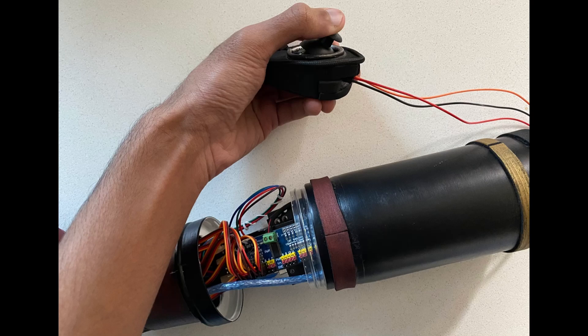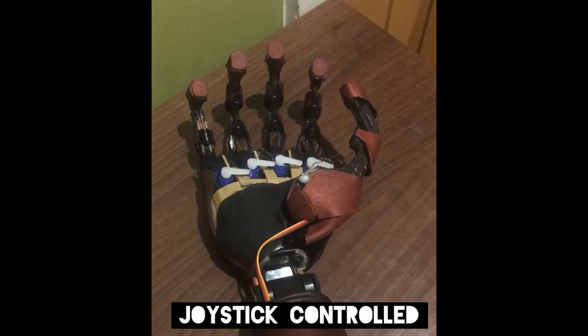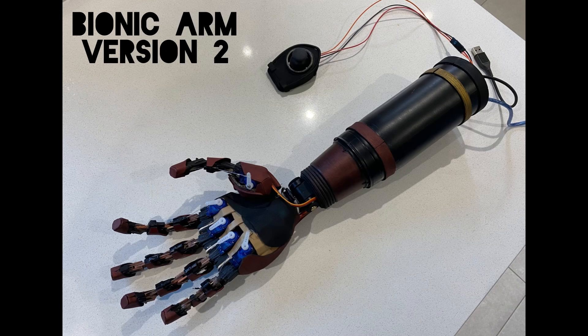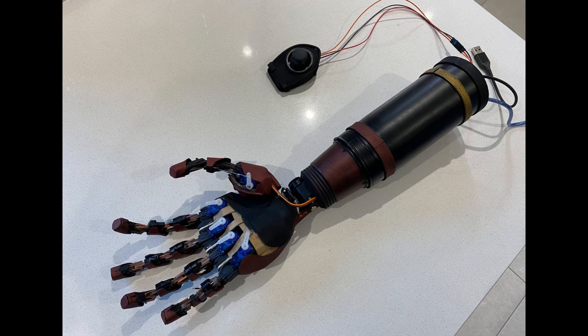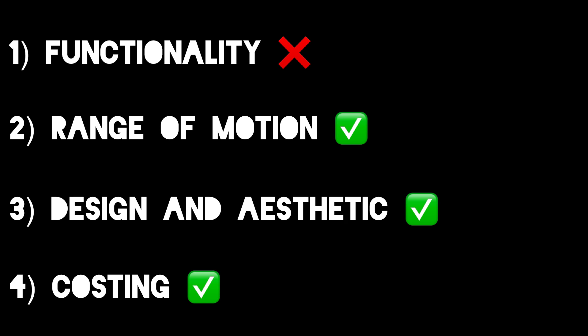Functionality-wise, this arm could make more of a convincing fist, but still not a proper one strong enough to hold onto objects. At one point, I rewired the circuit to be controlled by a joystick rather than a looped program, but this didn't allow individual finger control. Overall, this bionic arm was much better than my first iteration, but I was still not satisfied with the functionality and disproportionate size of this arm to my own.